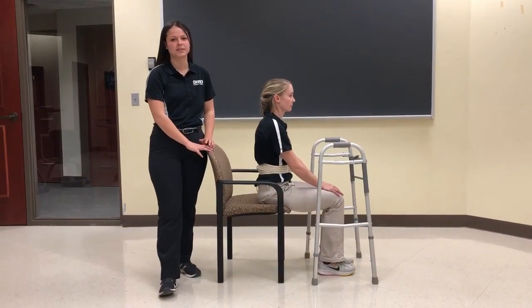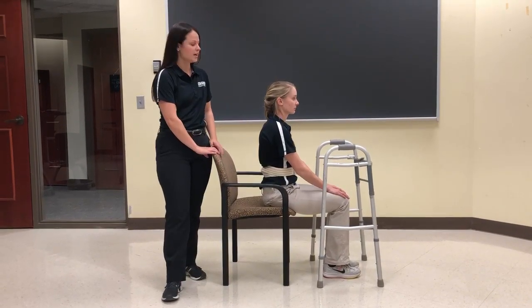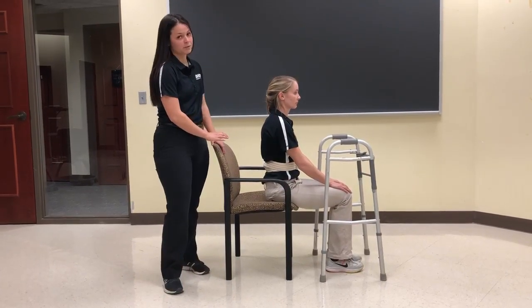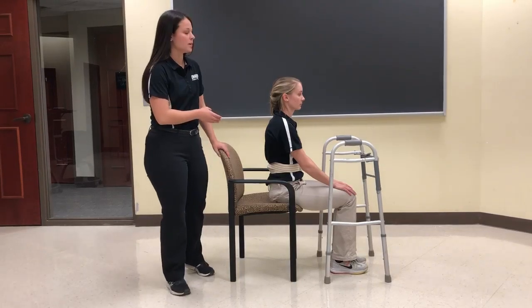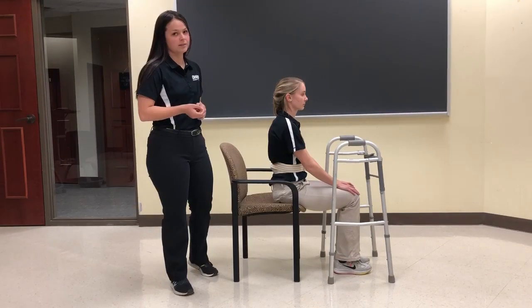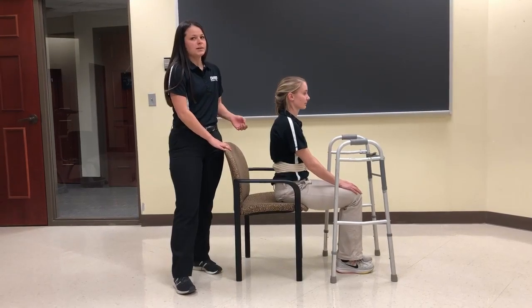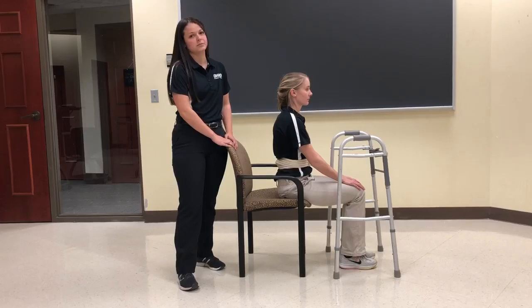To move your patient from a sitting to a standing position, you need to first make sure that the surface they're sitting on is secure and that there is a gait belt around their waist. You also want your patient to be as far forward on their seat as they are able to be. To begin, you will place the walker in front of your patient like so, making sure that the walker is close enough for them to reach but far enough for them to have room to stand. You will then stand behind the patient with one hand on their gait belt, maintaining close proximity and a wide base of support to ensure safety and to make the movement easier for yourself.